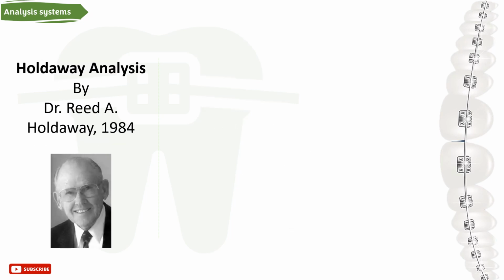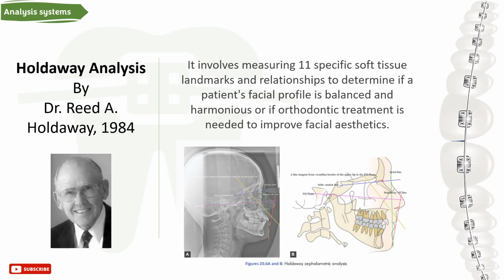Holdaway analysis. It involves measuring 11 specific soft tissue landmarks and relationships to determine if a patient's face profile is balanced and harmonious, or if orthodontic treatment is needed to improve facial aesthetics. So mainly it is concerned with soft tissue.